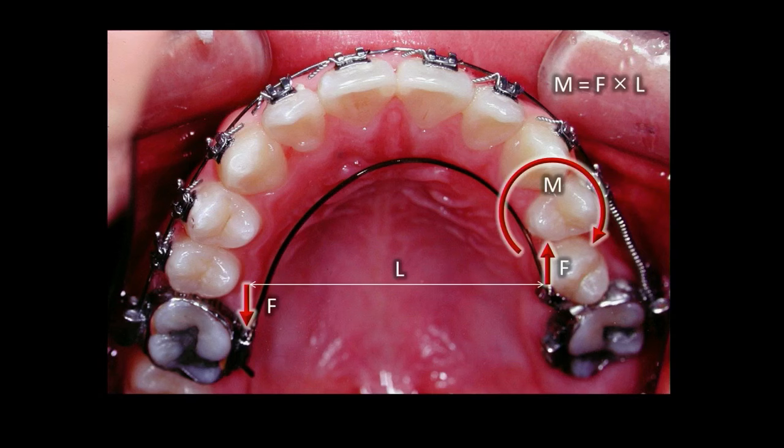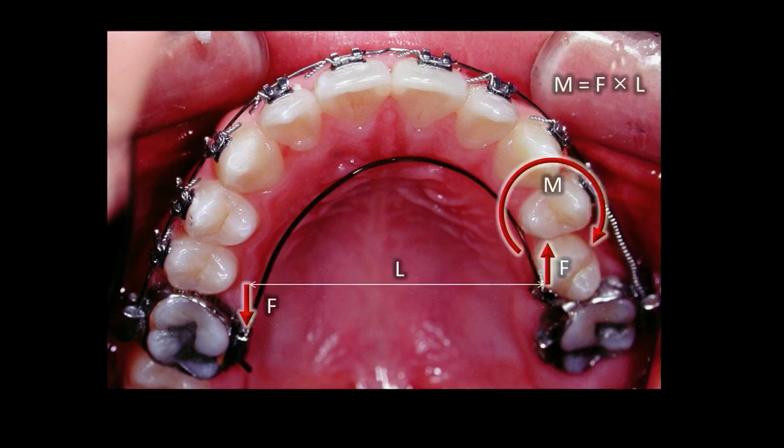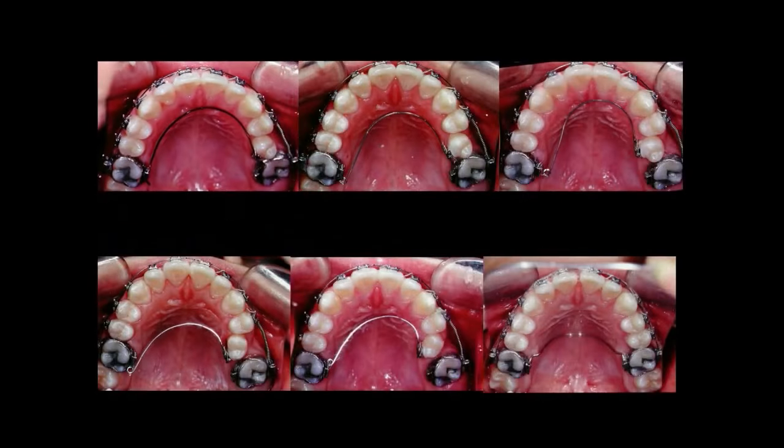Perhaps the distance between molar across the arch would be the largest interbracket distance that we can get in the oral cavity. Notice that there is no apparent side effects during the rotation of single tooth more than 100 degrees.